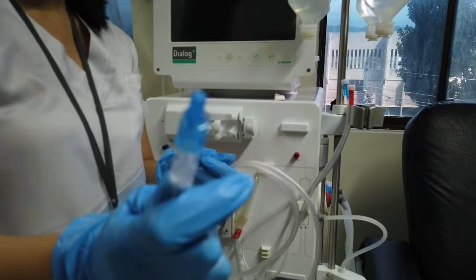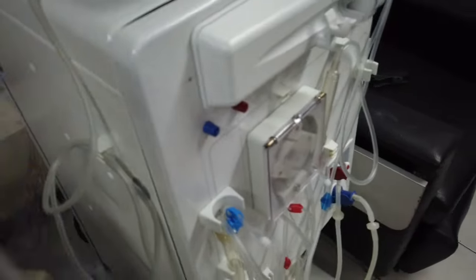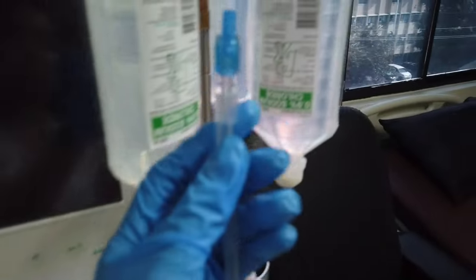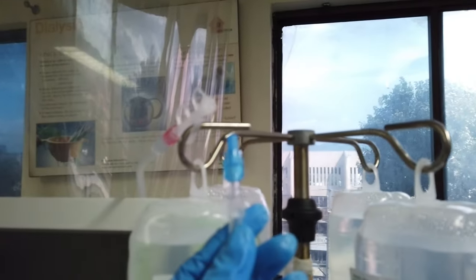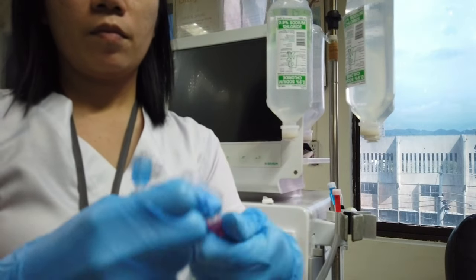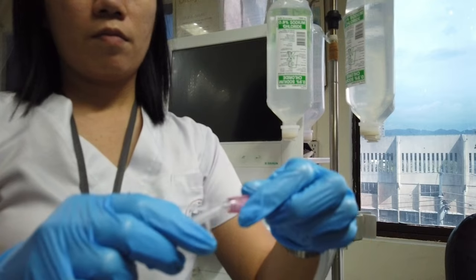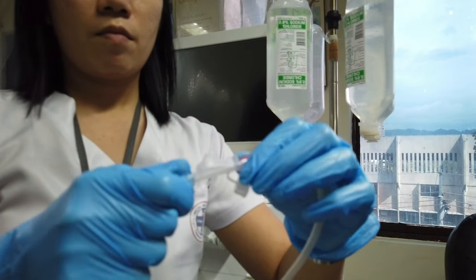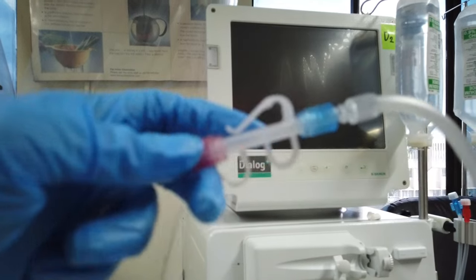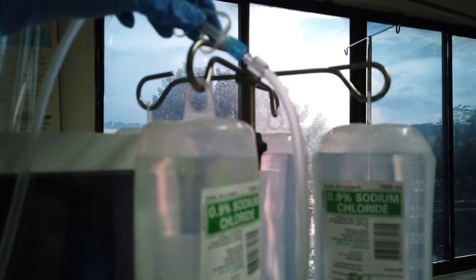Now for the patient's end line. Safely clip a part of its line. Then for the venous patient's end, we are going to connect it to the arterial patient's end. I know this looks weird, but I have a habit of transferring the connector from the arterial patient's end to the venous patient's end just for some coziness by the time I hook this into the drainage bin. Then carefully secure it to avoid it from accidentally falling.